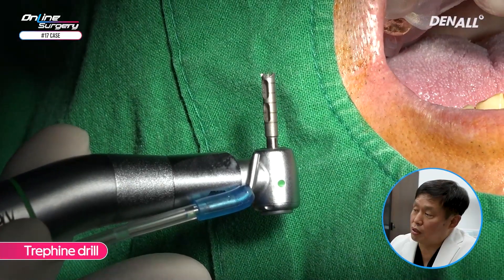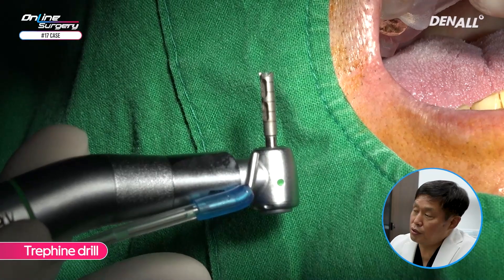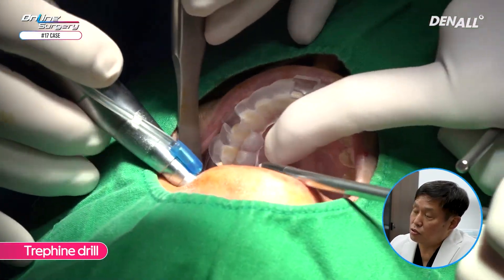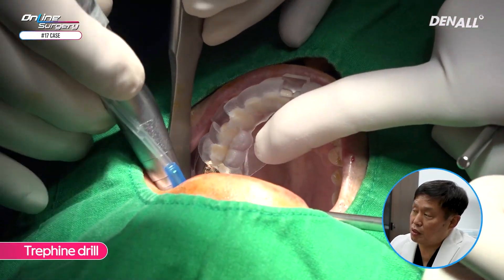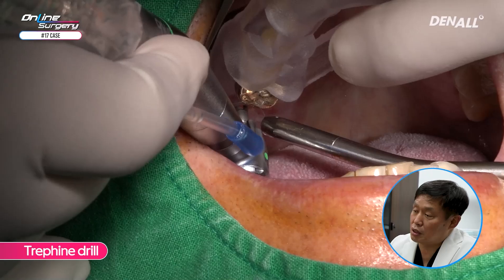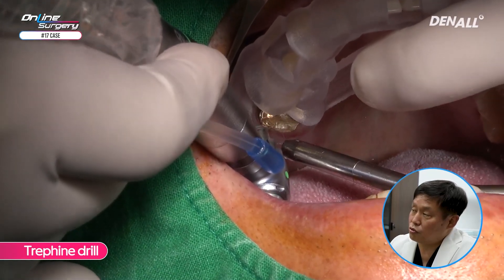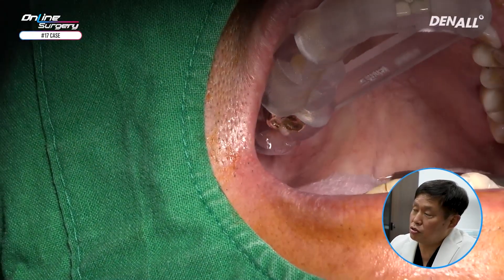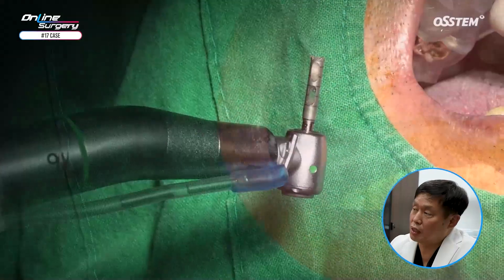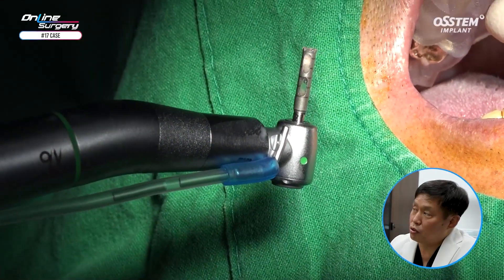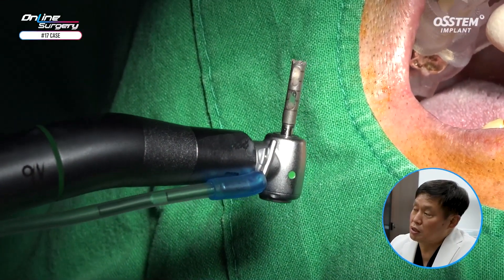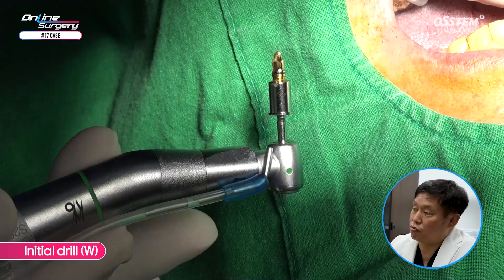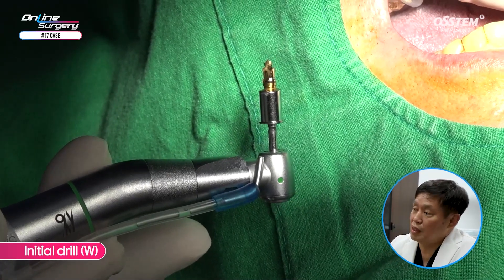For biopsy, a trephine drill was used. In the area where socket preservation with AOS graft material was done, I used the trephine drill to get a specimen to check how much healing had occurred. You can see that the specimen has been gained.